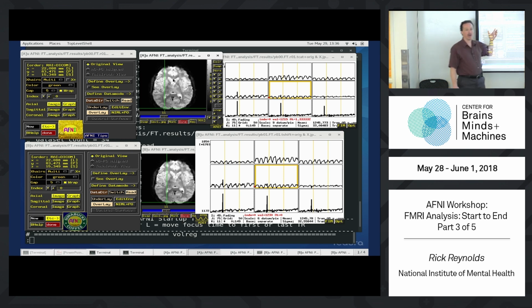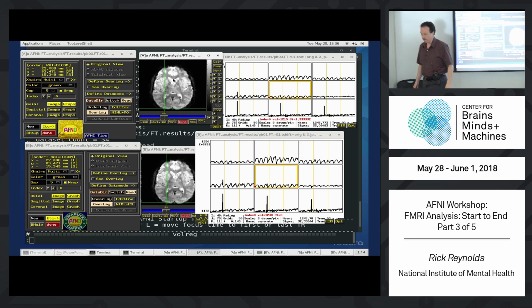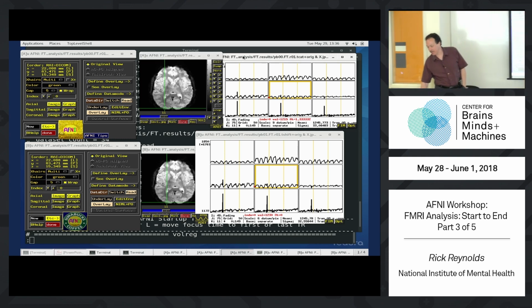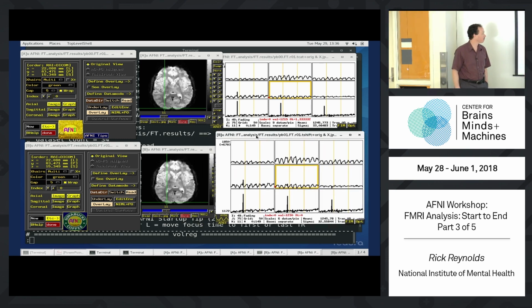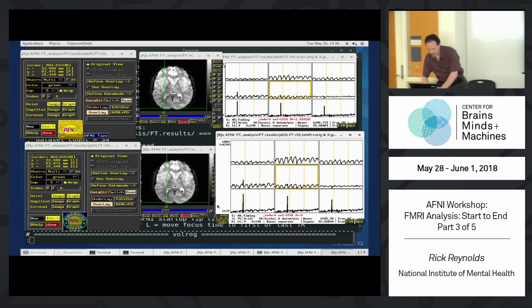And that's one reason that, remember, we use polynomial interpolants here instead of something like Fourier interpolation, because Fourier interpolation might actually make these spikes ring throughout the data a bit. So while Fourier interpolation is maybe the coolest sounding and most mathematically elegant, in some cases it does better, but in some cases there are problems, like with everything. Anyway, now we have data as if we acquired it at the beginning of the TR in one snapshot.